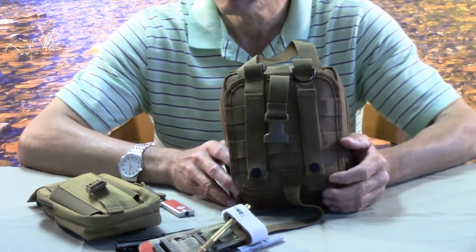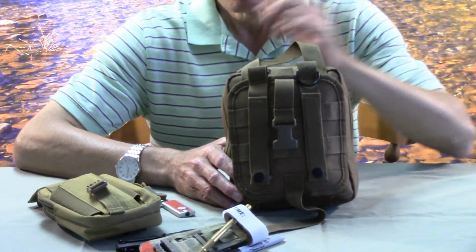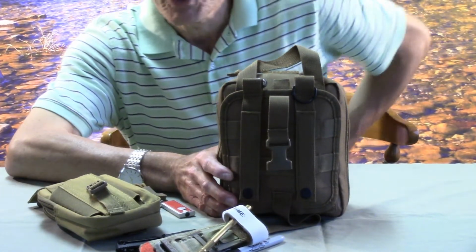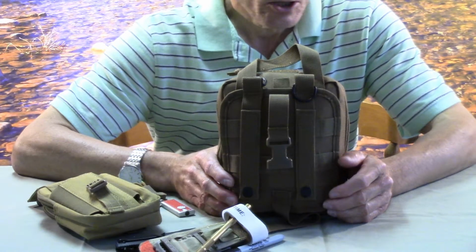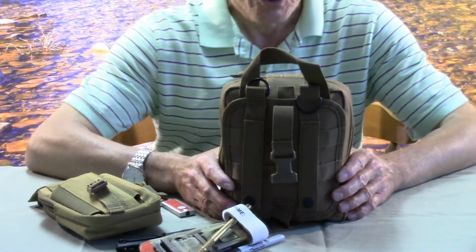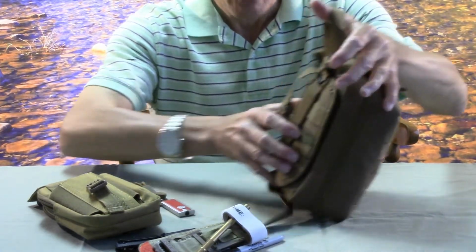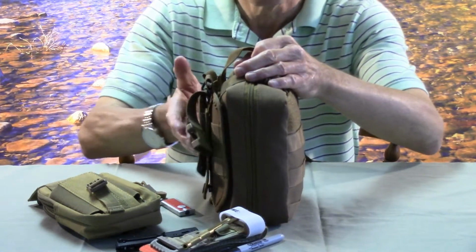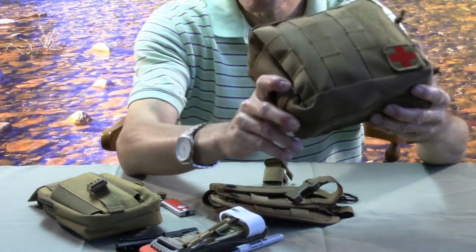Problem with that is a lot of people will put that on the back where they can't get to it. Some might wear it on their cummerbund or on their tactical belt on the side. If you run into a situation where you have to work on yourself, or you want to allow someone else to use this, it's not very convenient when it's attached to you. So what they've done is this little handle here. Let's just say my belt is going through here. This is attached to your belt. Now you've got it. It's very secure.